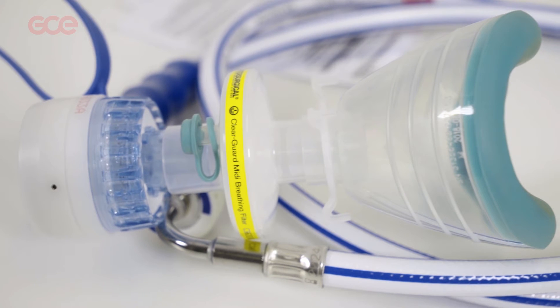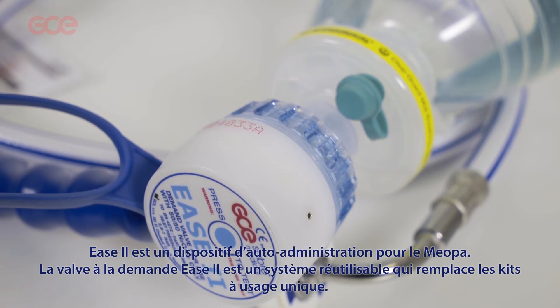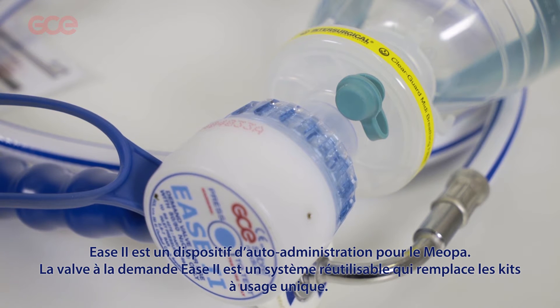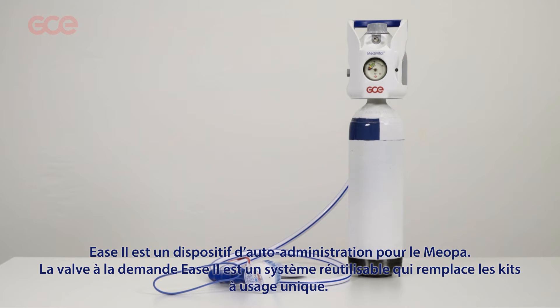The Ease 2 demand valve is a class 2a MD device. Ease 2 is a self-administering respiration device to be used for MEOPA. Ease 2 demand valves are reusable and replace the non-reusable kits.